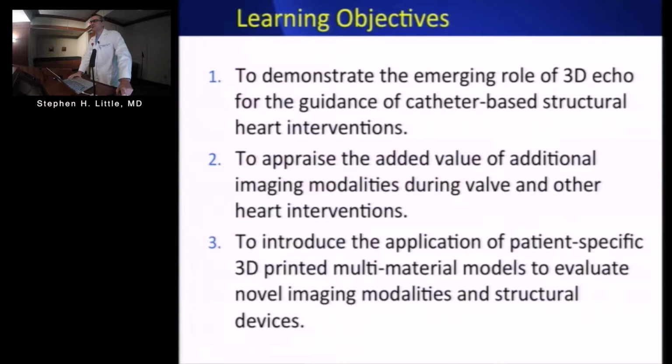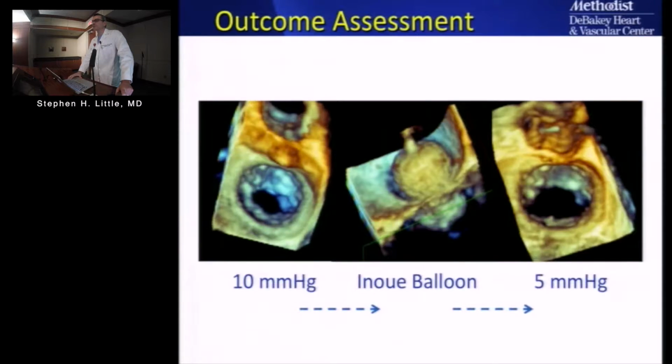A bunch of learning objectives. It's always good to try to tell you what I'm going to try to tell you. So: the emerging role of 3D echo for structural heart guidance, the added value compared to 2D, and an introduction to patient-specific printing, although for this particular talk we're not going to focus on that too much.